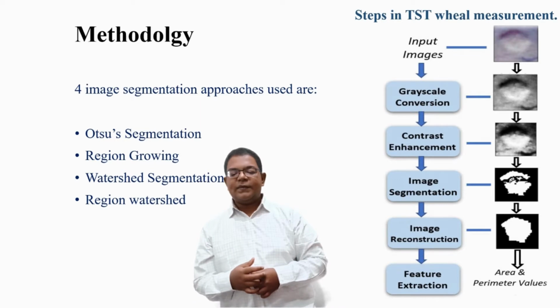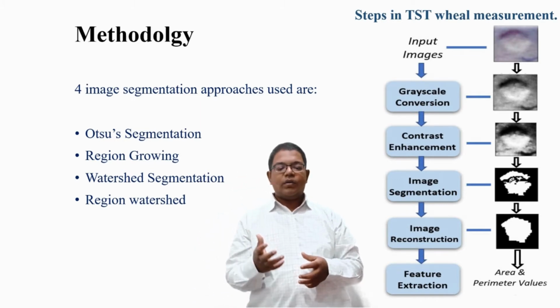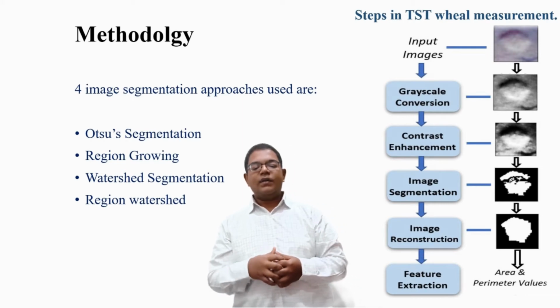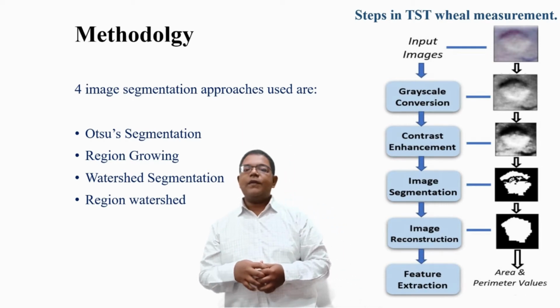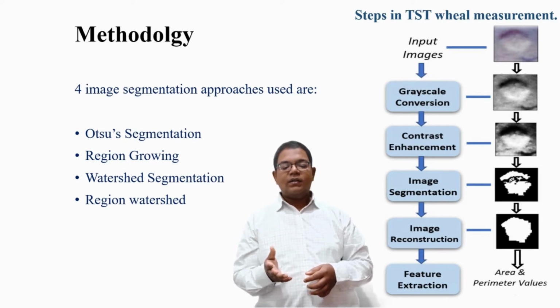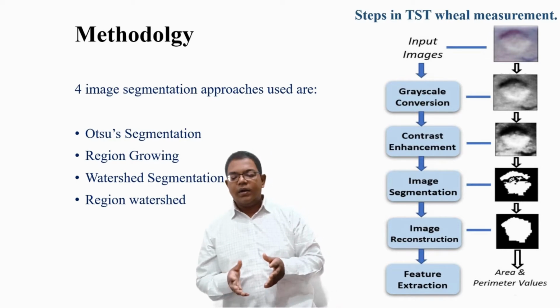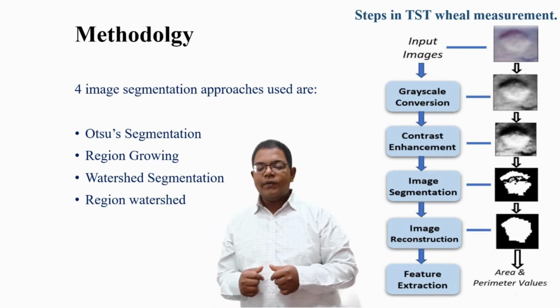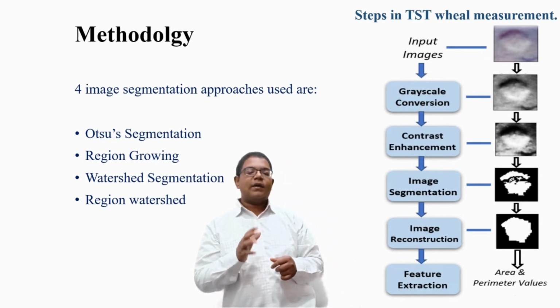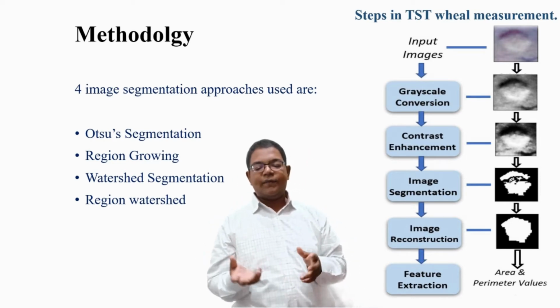So it treats pixels and their corresponding values as a local elevation, like a kind of topography, and has user-defined markers. The method floods the basins over the user-defined markers till the basins that are recognized for different markers run into watershed lines. So in most of the cases, the selection of the markers is in the local minima of the image, from where the basins are flooded.